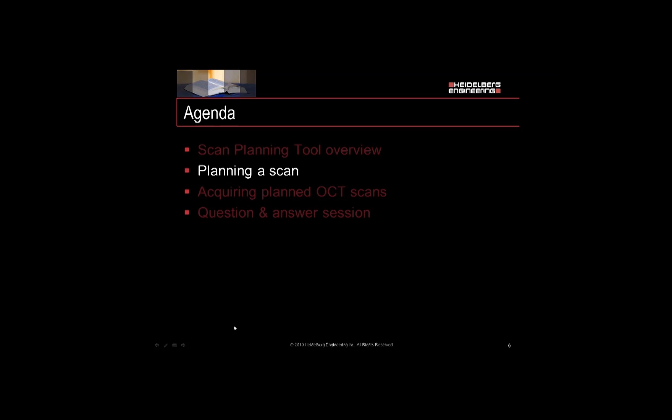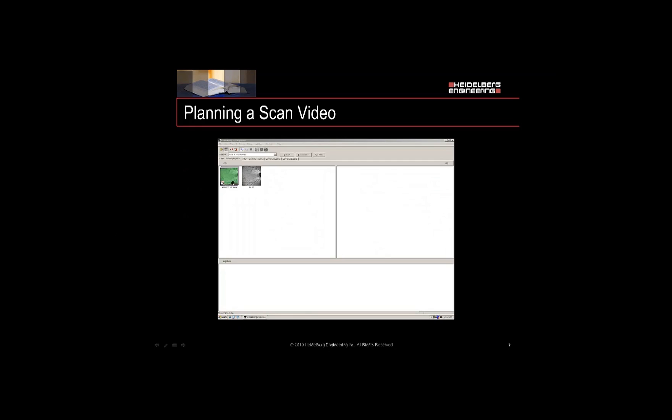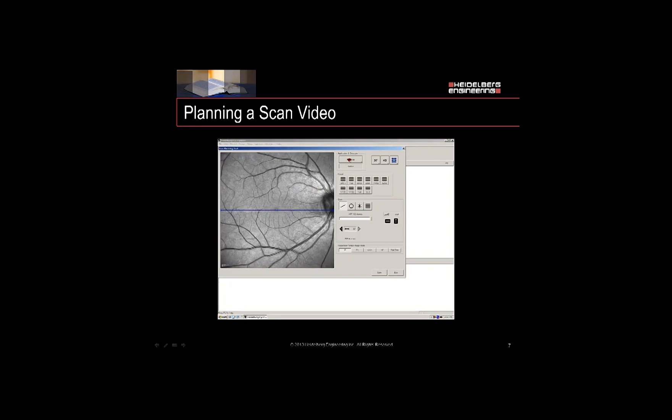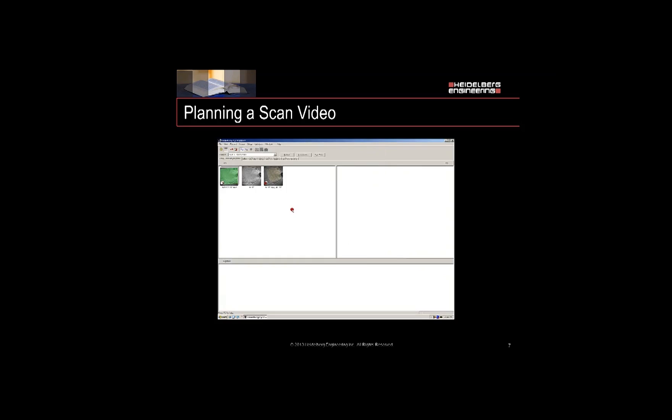Let's review how to plan a scan by watching a short video and then we'll go over it in more detail. On your fundus image, right mouse click and select Scan Planning Tool. You'll see the template has all of the same scan settings that you'll find in the Acquisition window. You can select the type of scan, angle the scan, move the scan, select what type of fundus image you would like, save, and exit. You'll see your scan in the image window with the yellow color-coded scan pattern.